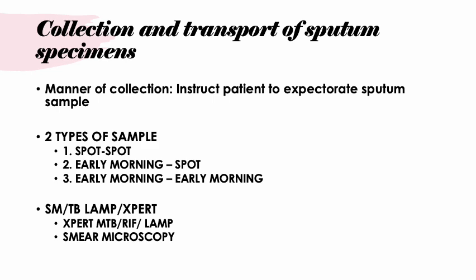It is usually done on first cases of patients, so that is the rapid testing. In follow-up checkups or testing, we do not usually do Xpert, but in certain cases some doctors still request Xpert testing for follow-up, for detection of progression of the disease and also the existence of MDR-TB in the patient.